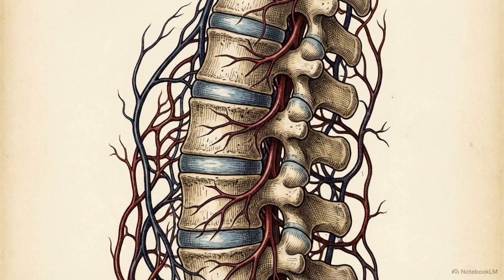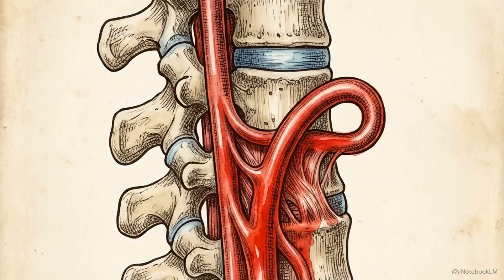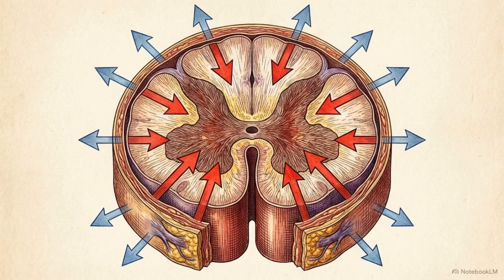This occurs when the graft blocks critical blood supply to the artery of Adamkiewicz. This distinct hairpin-turning vessel branches off the aorta between the T9 and T12 vertebrae and provides the primary arterial supply to the lower spinal cord. If a patient begins developing symptoms of paraplegia after the procedure, the immediate clinical intervention is emergency cerebrospinal fluid drainage. This lowers the physical pressure around the spinal cord, improving the arterial perfusion pressure driving blood into the tissue.